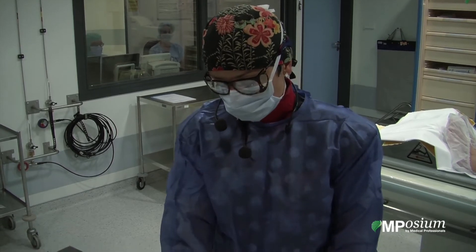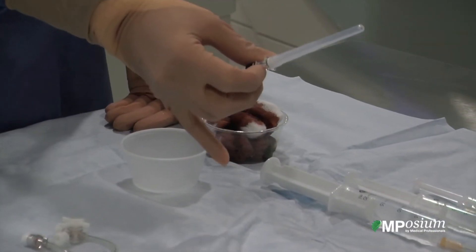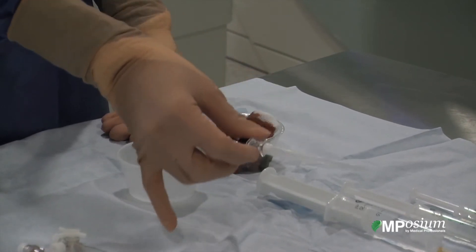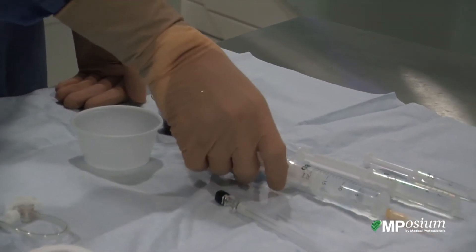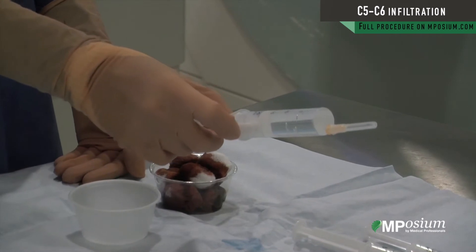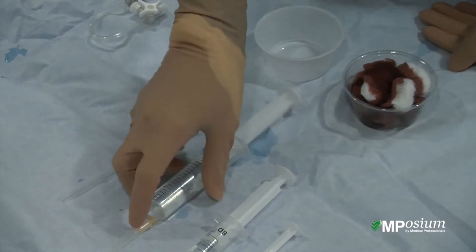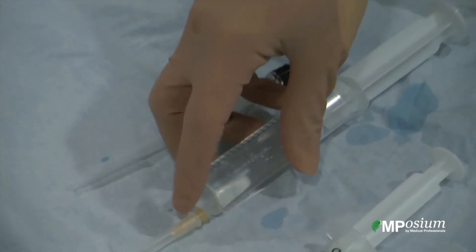We are using a spinal needle, 21 gauge, which will be placed inside the foramen. The local anesthesia for the skin is done with Xylocaine 1%, using a needle of 22 gauge.